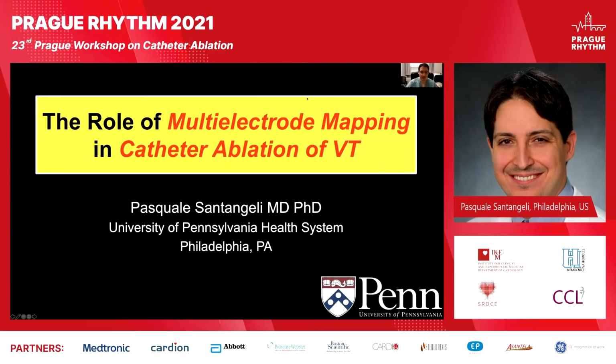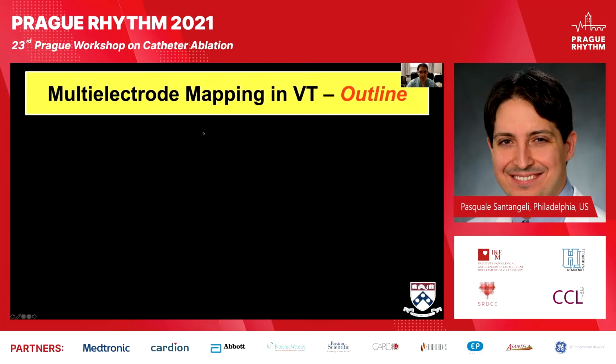Hello, this is Pasquale Santangeli from the Hospital of the University of Pennsylvania. I wish to thank Professor Kautzner for the kind invitation to this meeting. The topic that has been assigned to me is to summarize the role of multi-electrode mapping in catheter ablation of VT.